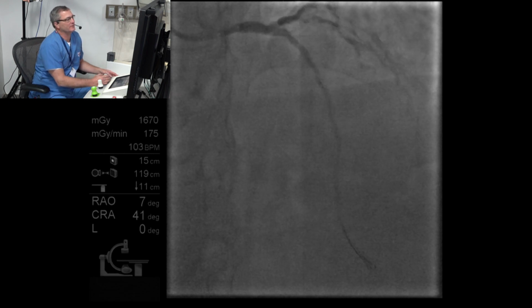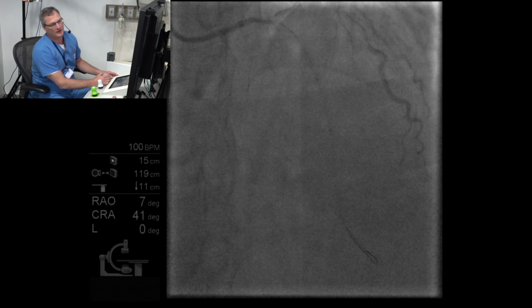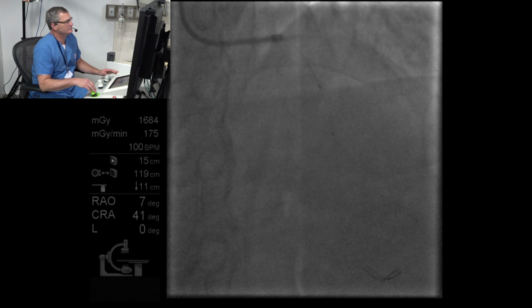I'm actually going to remeasure this. Give me a test, please, because it's really sucking the guide in and out. So this may not measure very accurately in this environment. What I do if this happens, at least I try to put my hand on that turbo button and try to push my balloon in, and then I pull it back. Yeah, I'm not going to be able to measure accurately with this. Give me another test.